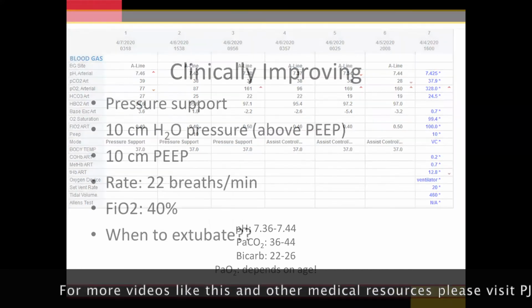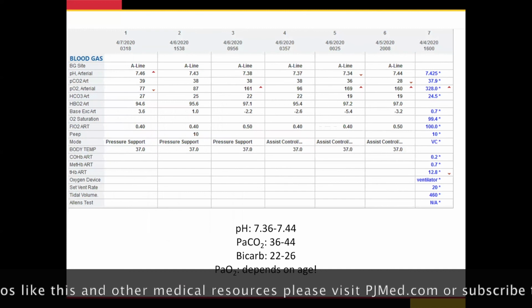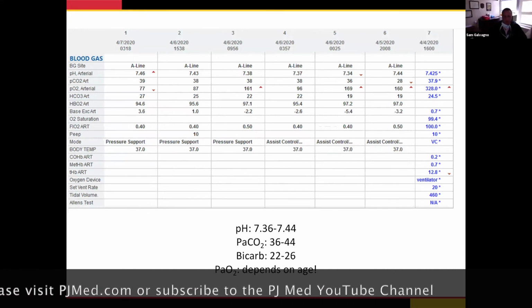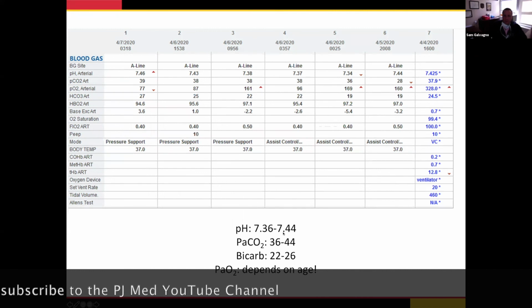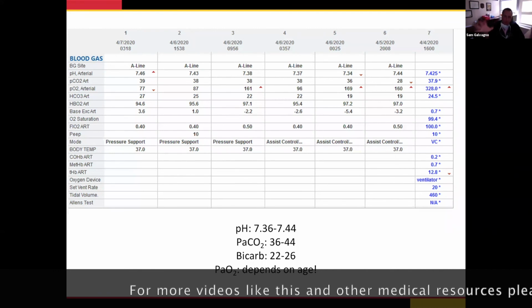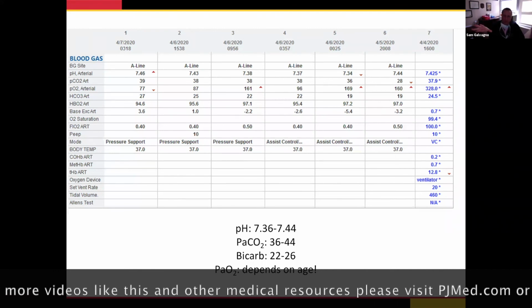Like, is he aware that he's intubated? Thank you. Excellent. So I've got the normal values laid down here, guys. So here's the thing. He is awake. He's a little delirious, so not quite ready to be extubated, because to be extubated, you're hitting on a really important point. You've got to have an intact mental status, okay?